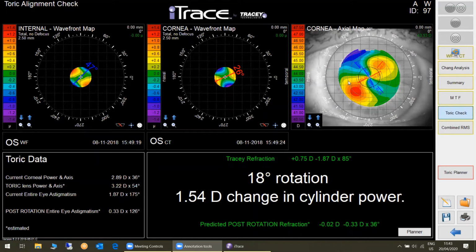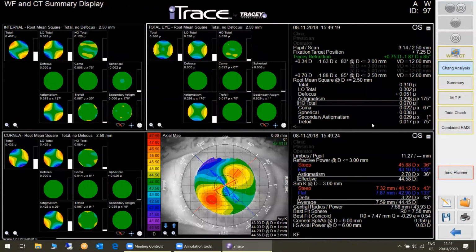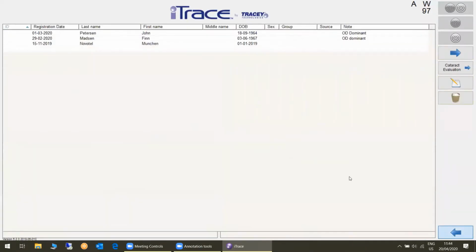So that's why it's very important that you only measure what the patient is using. In scotopic people say, look, I can show you that I also have 51. See here? I have 51. But the patient is using, oh, the 26 or 28. So this is a case that is very simple to explain. I have another one.